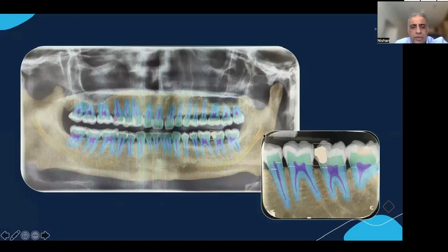Some of the other x-rays we took of this patient as well, you can see the OPG, again, Pearl. You can import the OPG into Pearl and it will show the carious lesions. It will go through some of the anatomy quite nicely. And it's all things you can explain to the patient. It looks very pretty as well. The patients can understand things very clearly. Pretty much a sense of co-diagnosis is really important.